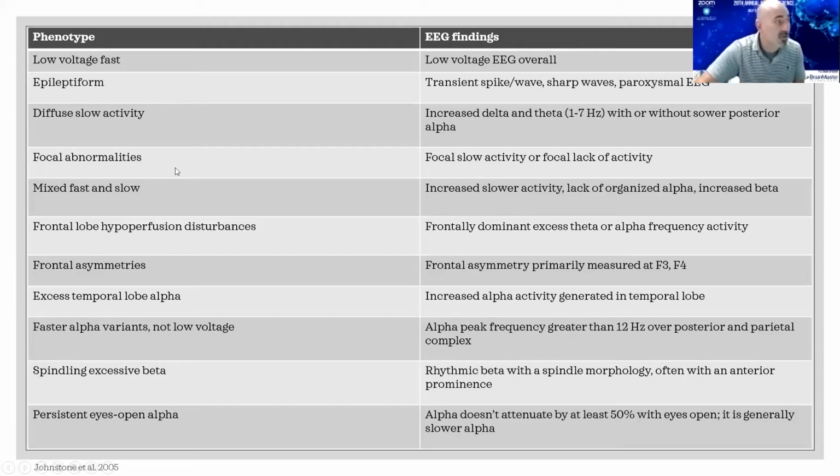Something to consider: focal abnormalities. These are localized, and when you see specific localized dysfunction in the EEG, it's really a case where you're probably going to want to refer that to a neurologist and get an expert opinion on this, because something, whether it's ischemic, there's a blood flow issue, or there's some kind of blunt trauma to the brain, you would be well served to get a second and medical perspective on this before you go ahead and treat it. Don't be afraid to refer out and to work in collaboration. I work with Harry very closely. I really recommend doing so.